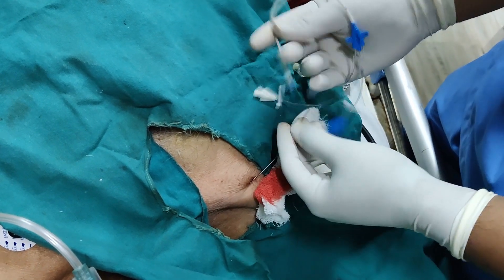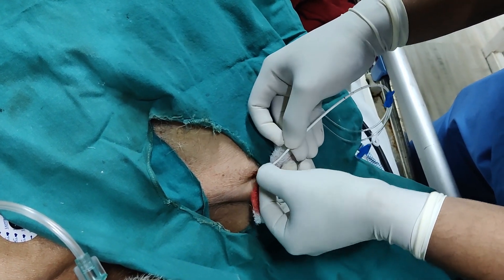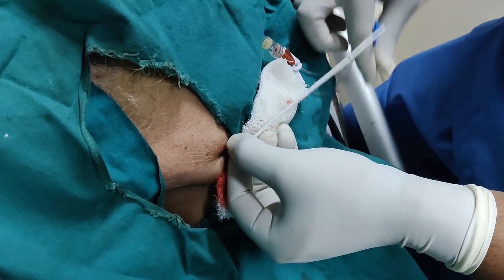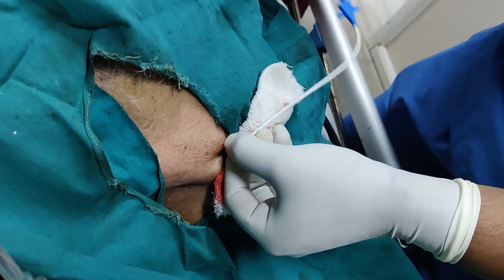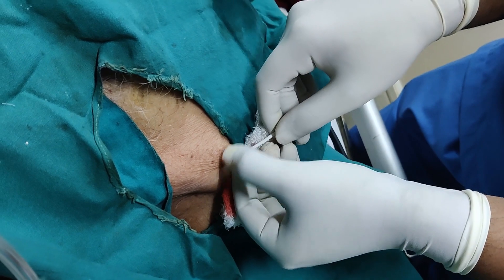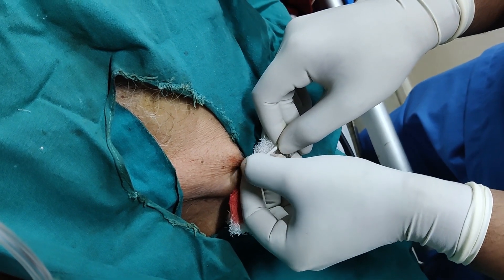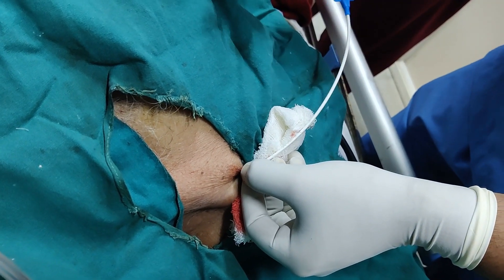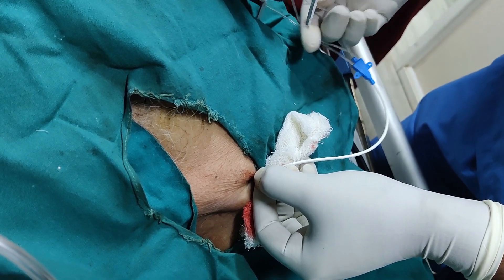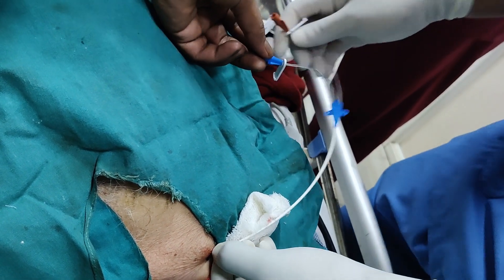Advance the catheter over the guide wire to the skin surface. Hold the guide wire fixed at the skin surface, thread the catheter tip over the distal end of the guide wire, and slide the catheter down to the skin surface. Continue to advance the catheter into the vein, grasping and controlling the guide wire where it protrudes from the hub. Hold the catheter near its tip and insert it through the skin, maintaining your grasp on both the guide wire and the catheter.